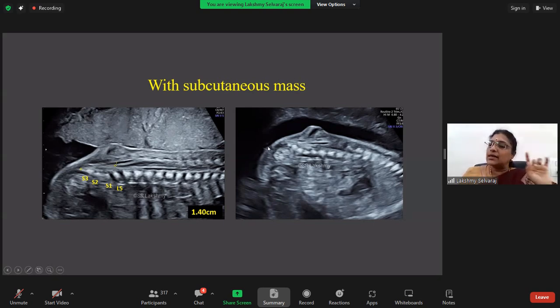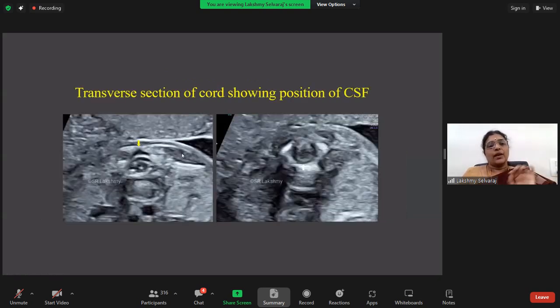In these conditions, the intracranium would be absolutely normal. When you take the axial section, this is once again a normal for comparison, what I just showed. There will be a divergence of the spinal pedicles. They will not converge with each other, and you see the cord lifted up.